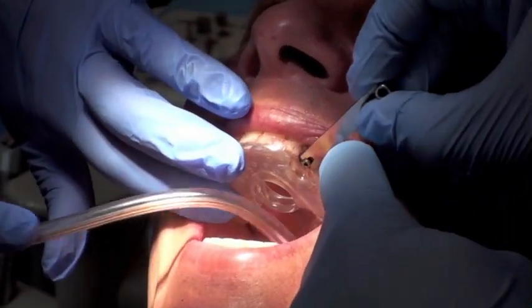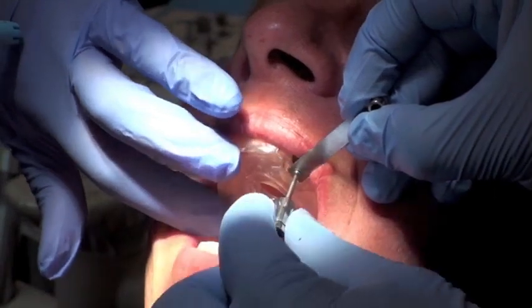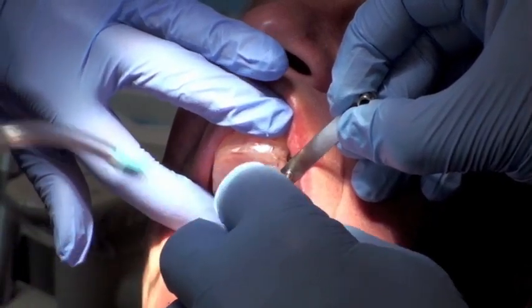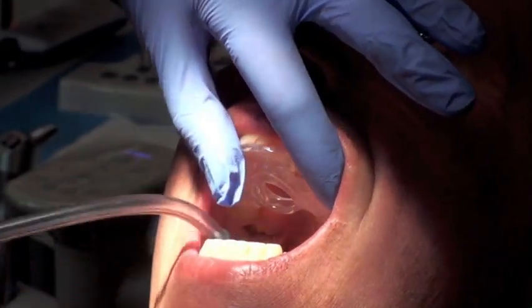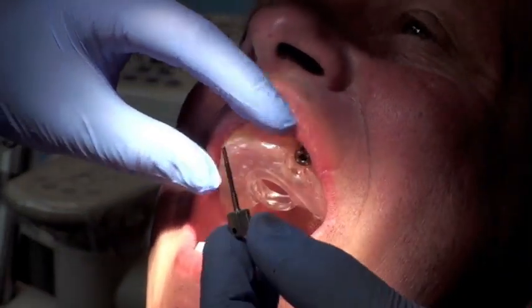Once the screw is released, a key is used to back out the screw completely so that I have access to the screw hole of the implant holder. And once the screw is removed, there's actually an implant holder removal tool. That's what you see here.